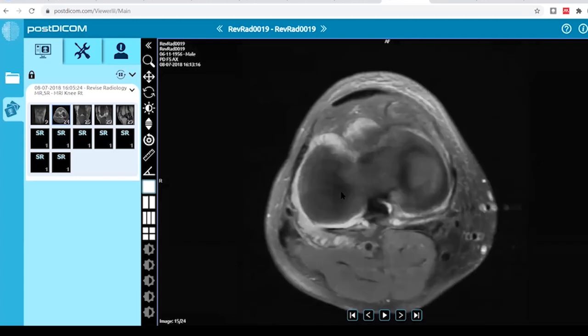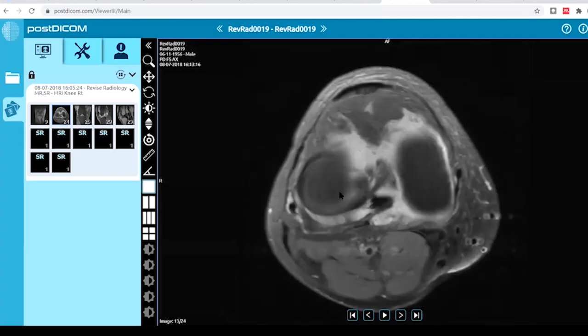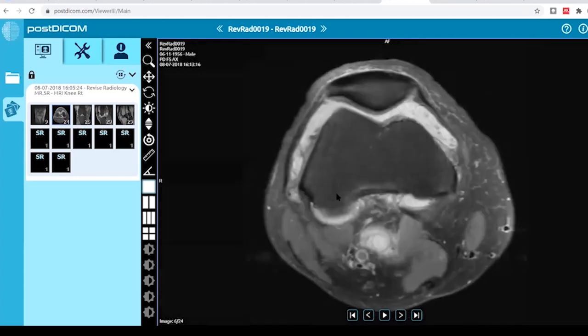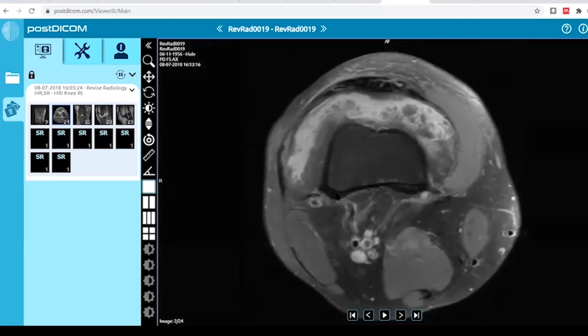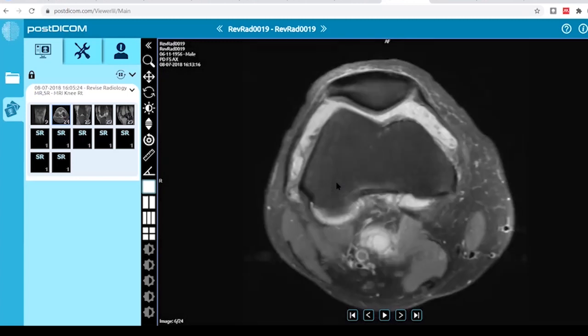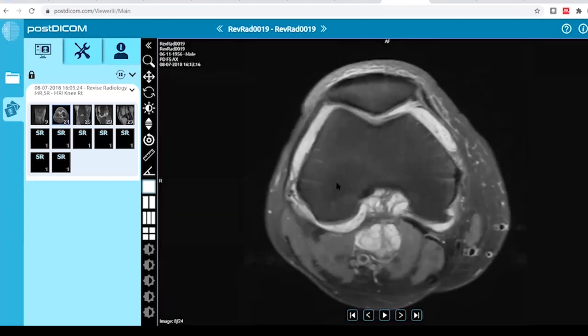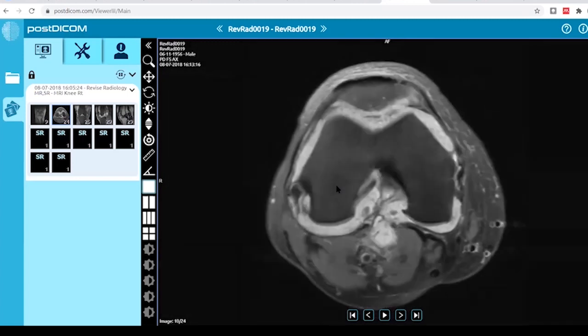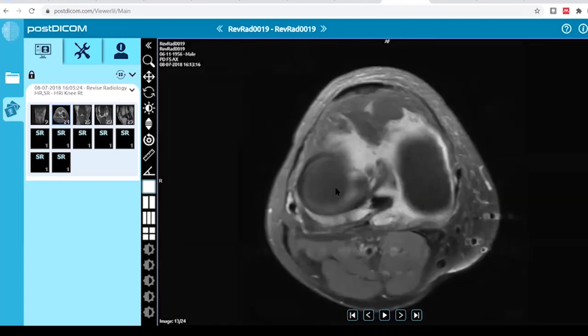I do not appreciate any marrow edema in this patient. There is no cortical break and the chondral cartilage looks intact.